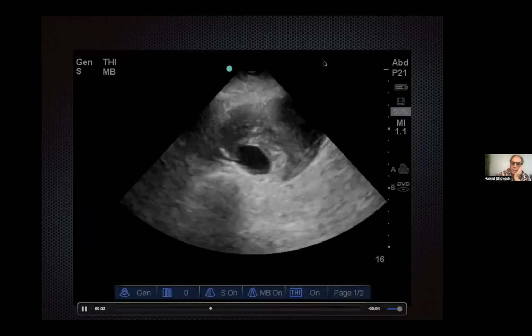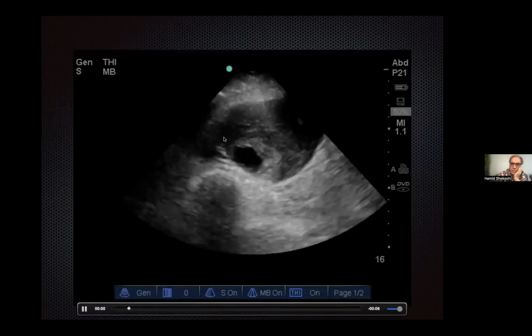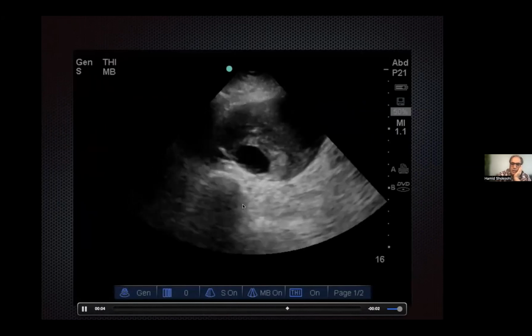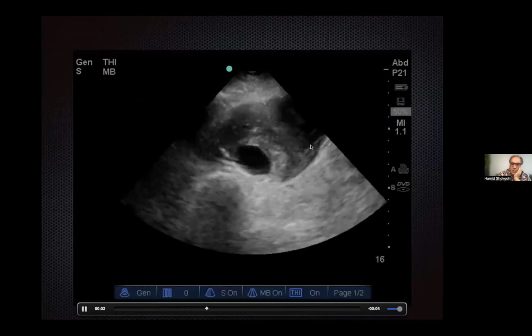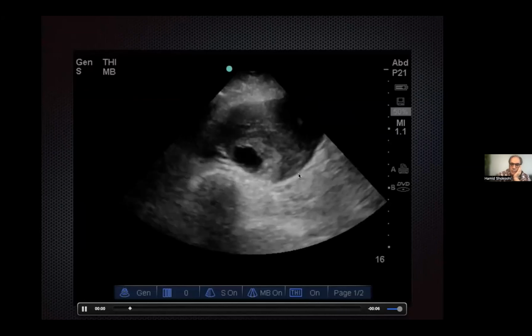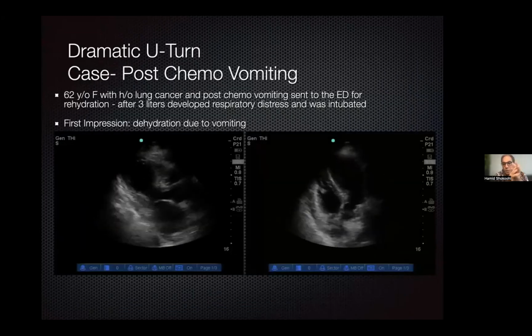This is another picture of the aneurysm, and don't mix up this one. Don't be confused, this is a pseudolumen. Vertebrae here, pseudolumen here, and this is all bleeding in the wall of the aorta. This is intramural hematoma. So, as I said, I'm not going to talk about pneumothorax and FAST and stuff because you guys know.